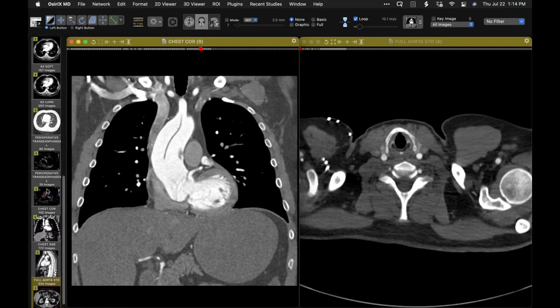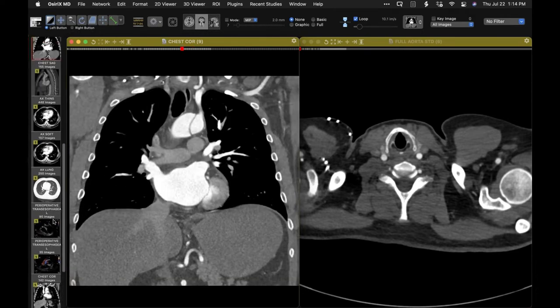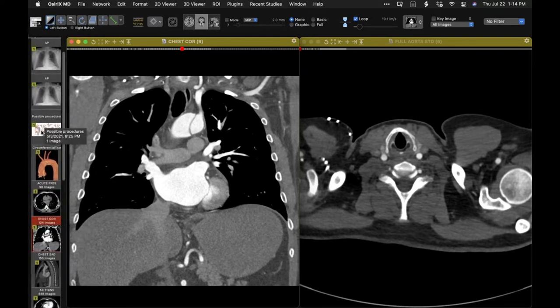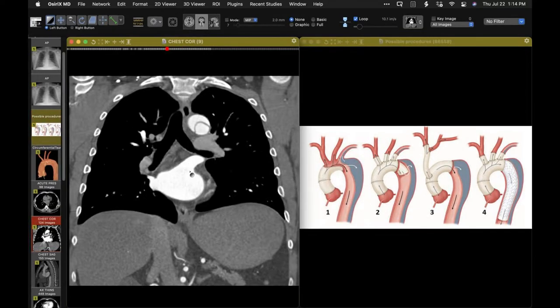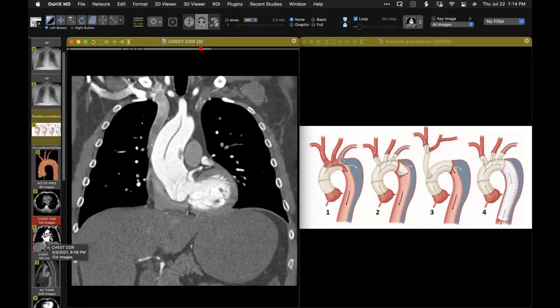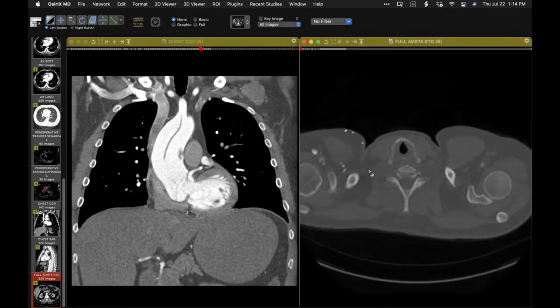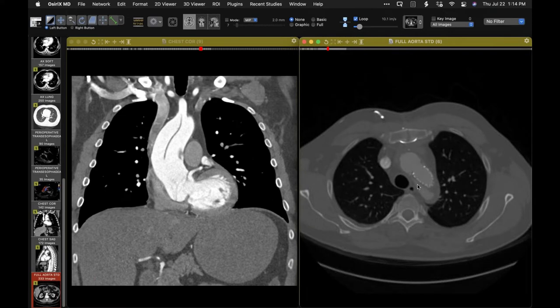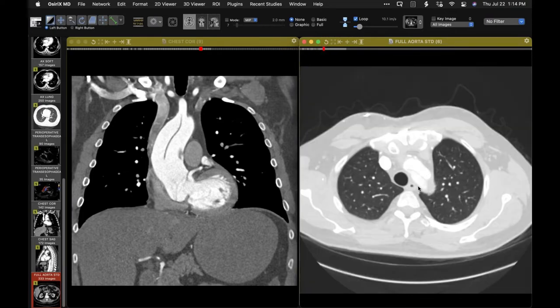So I do wonder for sure whether, had the surgeon known that in advance, that instead of doing a hemi-arch, which is here, he would have done a complete arch to try to deal with that communication between the two lumens at the time of the initial operation. Because now they're faced with somewhat of a dilemma post-op of a persistent communication between those two lumens. And of course, this frozen elephant trunk, the proximal landing zone, obviously does not get to where the persistent communication is.